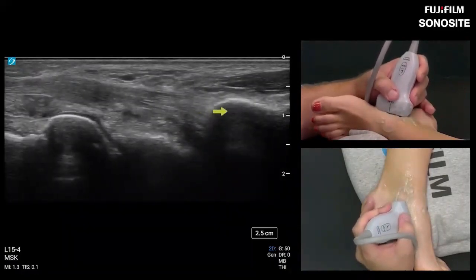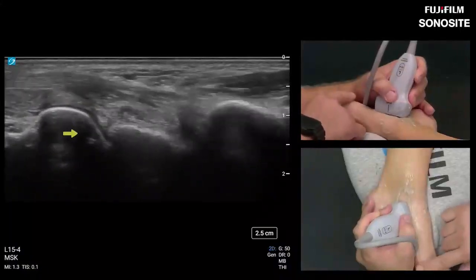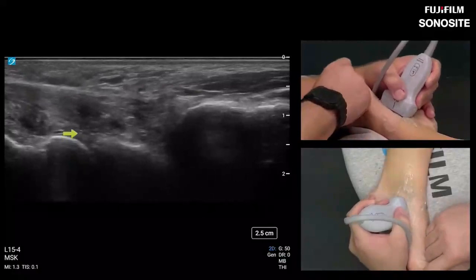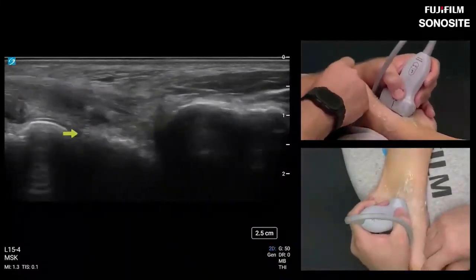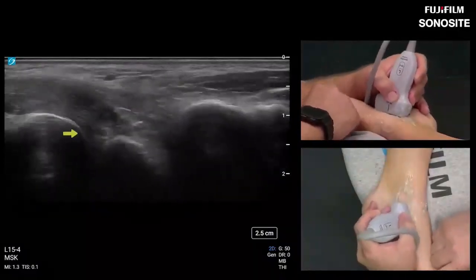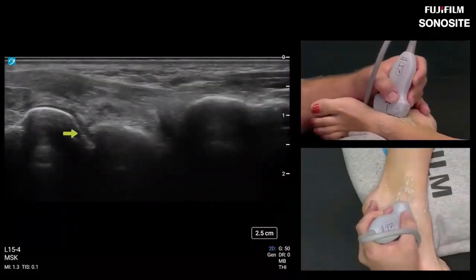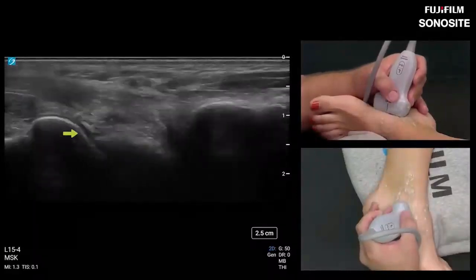So this is navicular, here's the talus, and I can just cause a little bit of motion to that tendon, can loosen the tendon passively and see if any fluid bunches up into those tendinous fibers. But that's one way to do a dynamic exam, is just to lift the navicular with the first metatarsal, basically. So that's a long axis.